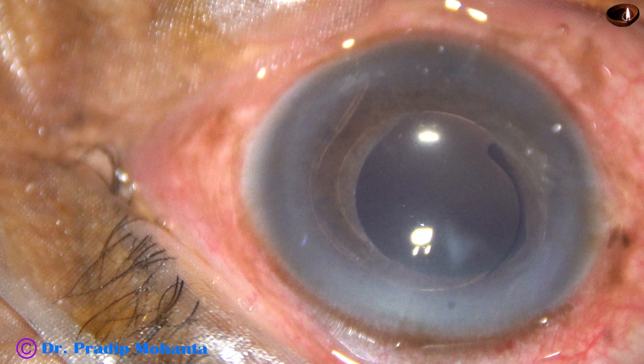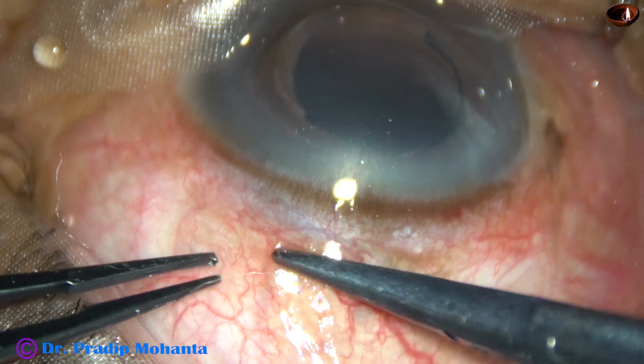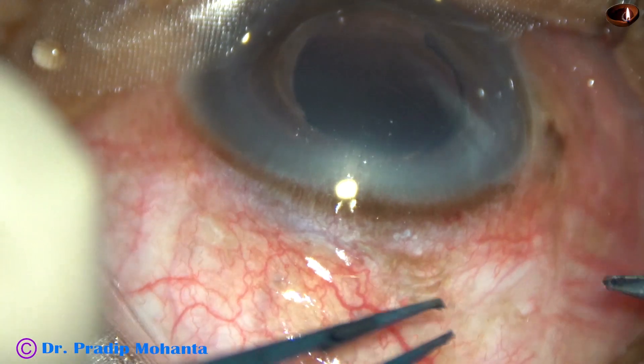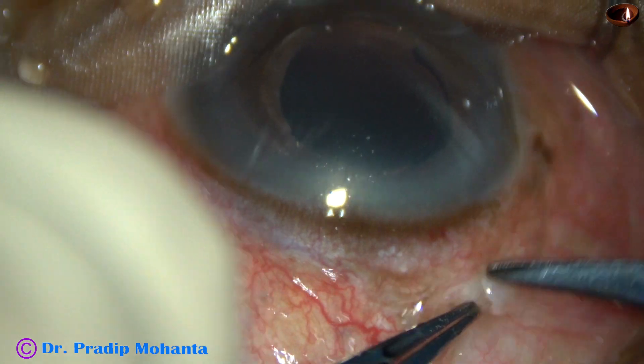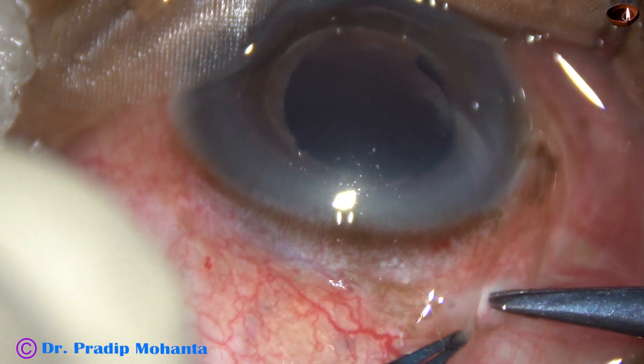Done elsewhere, this is an anterior chamber intraocular lens implanted without a PI. The patient has developed secondary glaucoma and came to me with an intraocular pressure of 36 mm of mercury.